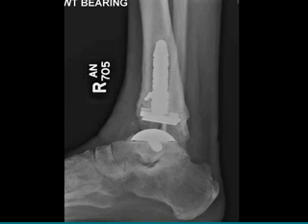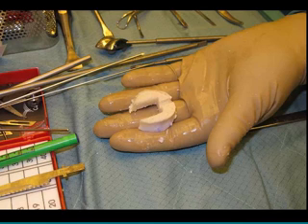And he came back in, and this is at about a year, and you'll see that the base plate to the INBONE prosthesis is crooked now, and it was straight. And so it's clear to me that he's fractured the tibial stem, something that's very uncommon. Well, when I went to do the revision and I cleaned up everything, I ended up with a larger space than they had a polyethylene. The largest polyethylene is 14 millimeters.